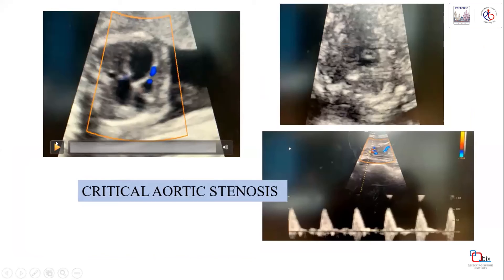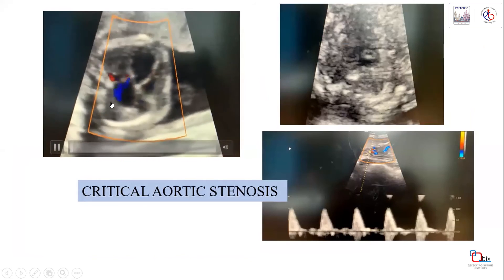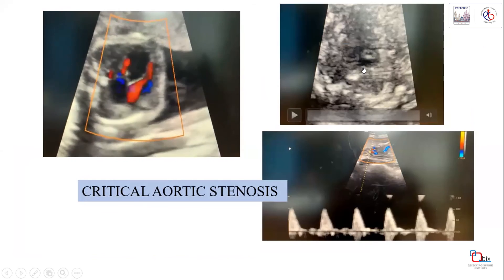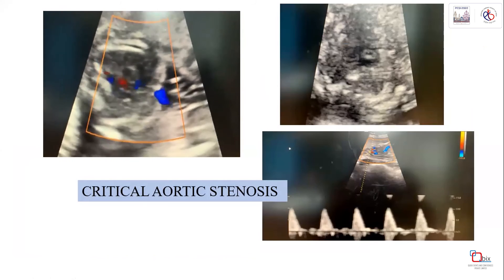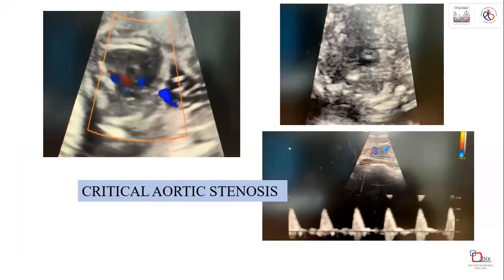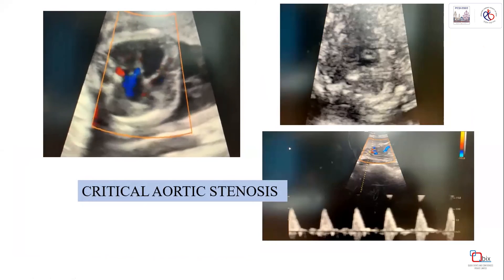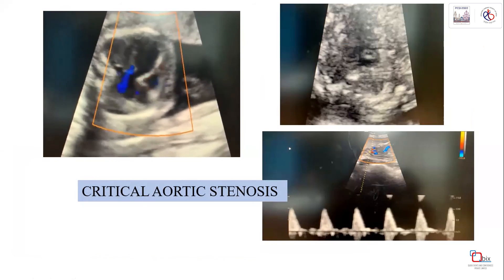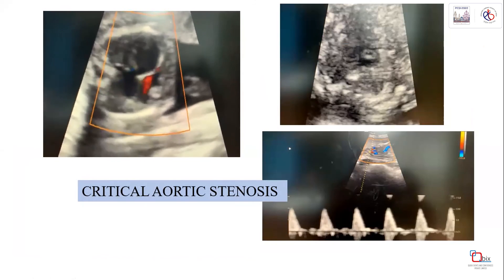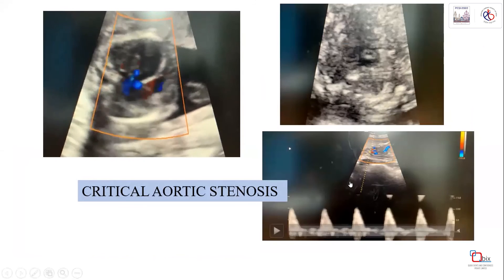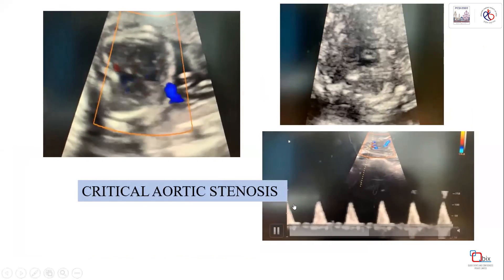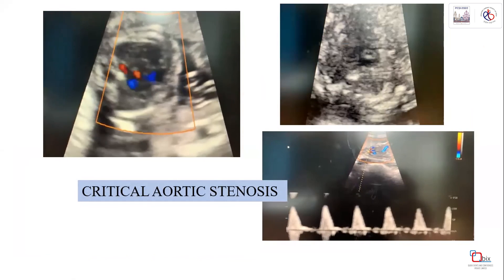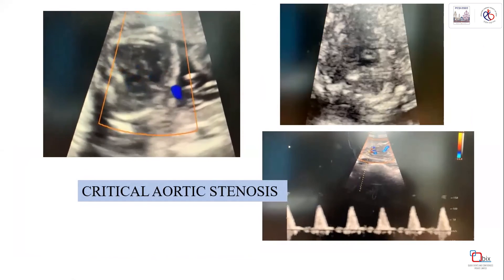This is a case of critical aortic stenosis causing ballooning of the aorta. The color flow shows how the jet narrows into the dilated aortic segment. Color flow provides additional security in diagnosis beyond structural imaging alone. Pulsed wave Doppler with peak systolic velocity measurement and other criteria also play a role, but color Doppler remains essential.